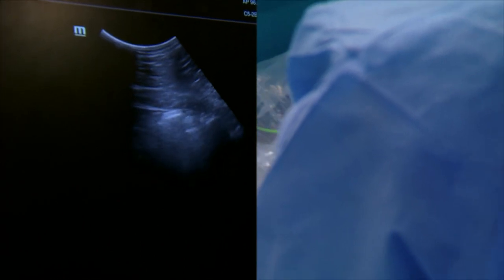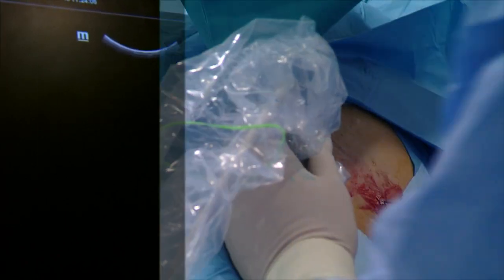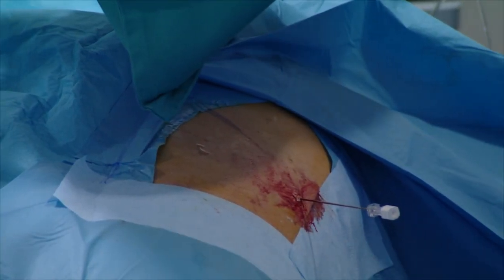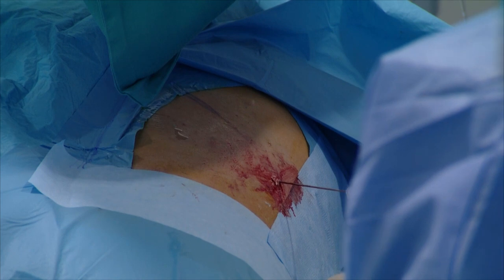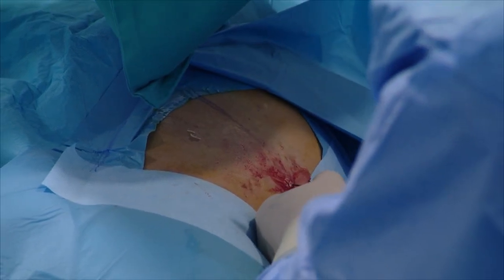Fluoroscopy, please. In this case, you can help with the fluoroscopic view. Now we have X-ray. Could you show the X-ray, please? Okay, we are next to our target area. We inject a little contrast dye with methylene blue. And what I now know is that I'm only millimeters away from my target.